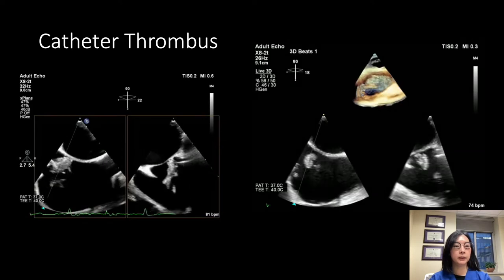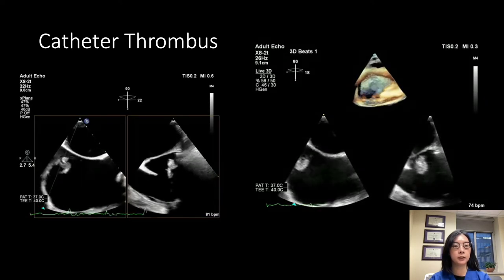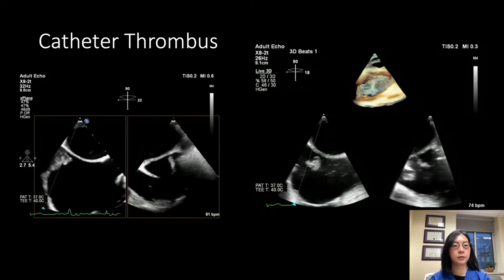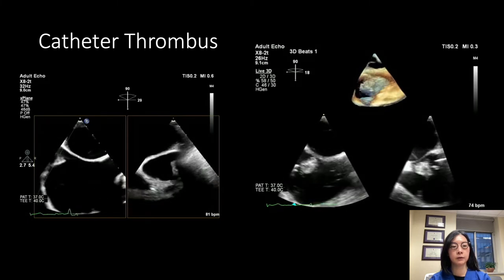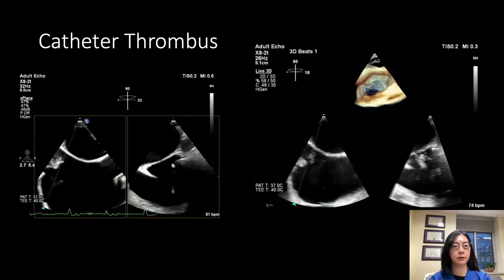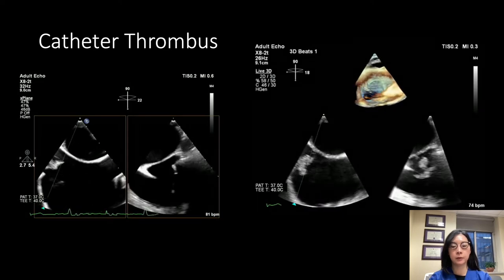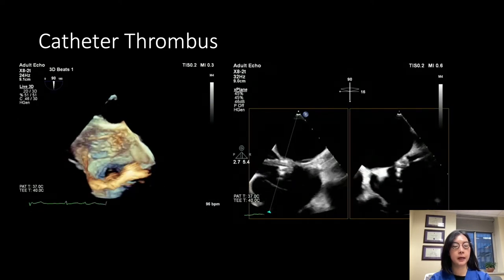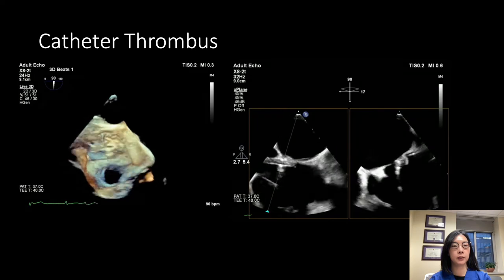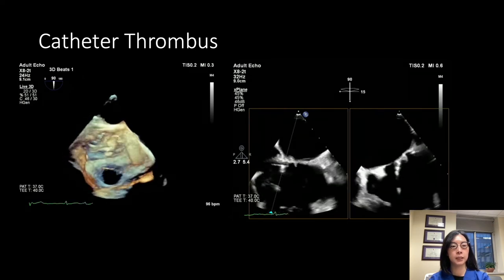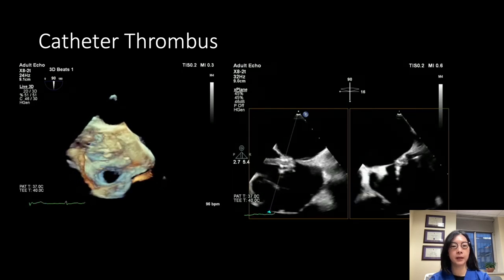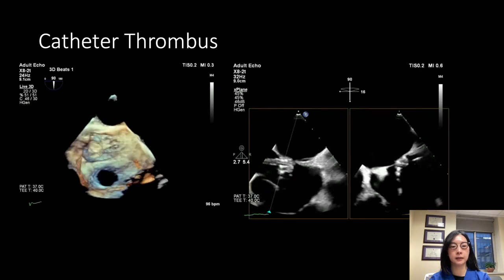This is a complication that sometimes occurs — we can see clots develop on catheters on either the left atrial or right atrial side. In this case, our wire was crossed and as we were waiting for the device to be prepped, a clot started to form. Heparin was given but the clot continued to get larger. The solution was to not move anything but to get a suction device to retrieve the clot. On the 3D towards the end, you can see the suction moving up, the clot moving into the device, and on the right image the end of the clot being suctioned into the retrieval device.